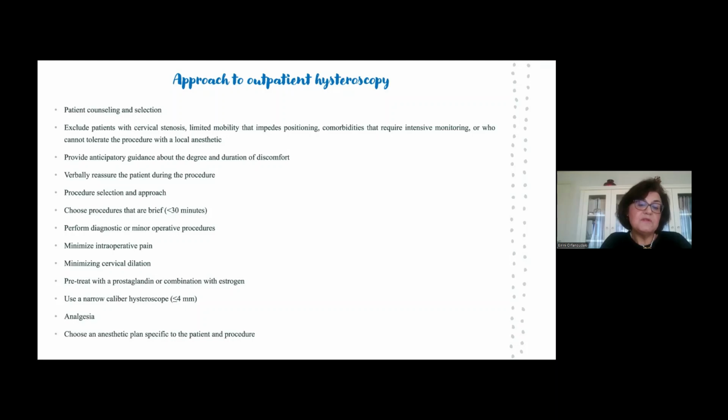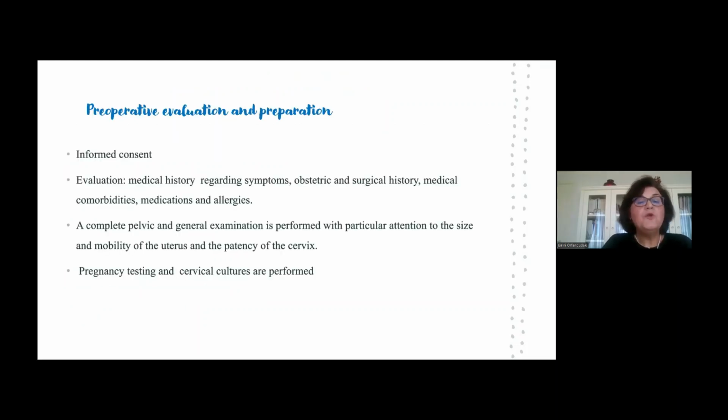Pretreat with a prostaglandin or combination with estrogen. Use a narrow caliber hysteroscope, less than 4 millimeters. Analgesia: choose an anesthetic plan specific to the patient and procedure. Preoperative evaluation and preparation: informed consent.